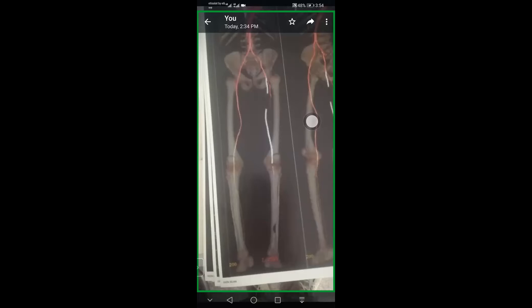The patient had failed two previous attempts to cross this lesion — one was retrograde through the infrapopliteal, and another directly from the distal stent. But it failed on all these trials.